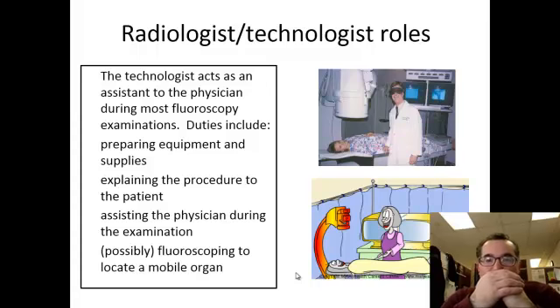So your role as a technologist. Well, if you see over here, this is actually a radiologist or physician. It wouldn't be the technologist, because he's wearing these red goggles, and those were designed to try to improve the brightness. Fluoroscopy procedures were generally done in very dark areas. Now with the image intensification tubes that we have, as well as the monitors giving us nice bright images, there's no use any longer for these types of glasses to be worn.